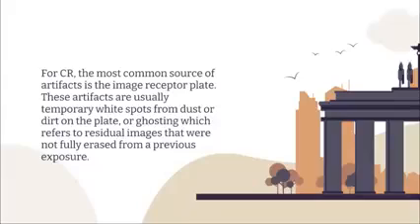So ghosting occurs when your imaging plate is not properly erased or cleaned. Okay? The accumulation of permanent scratches on the plate, the non-uniform performance from aging phosphors, so the accumulation of permanent scratches on the plate, so it gets scratched, okay?